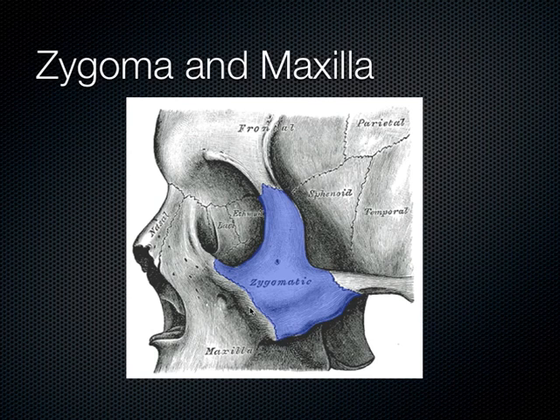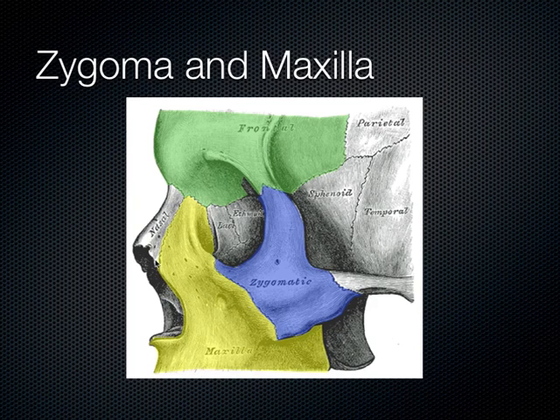It's usually broken in two places. You can think about some of the rings in the pelvis. That happens as well. But we can see the various bones here on ultrasound. Actually, we can see the frontal bone quite easily, and we can make out the maxilla as well. Even the nasal bone is seen quite easily on ultrasound.